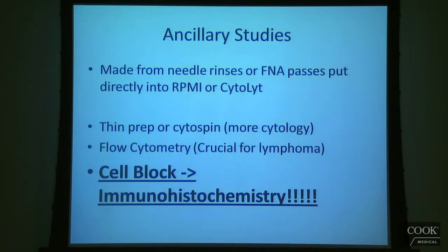So if we're worried about lymphoma, we'll say, get a bunch so we can send it for flow cytometry. And that's basically what that is, to distinguish, A, is it lymphoma or benign if you're dealing with lymphocytes, like you're in a lymph node, or B, once you're sure it's lymphoma, what kind of lymphoma is it? That's what flow cytometry can do for you. But that's, again, sort of the minority of cases.